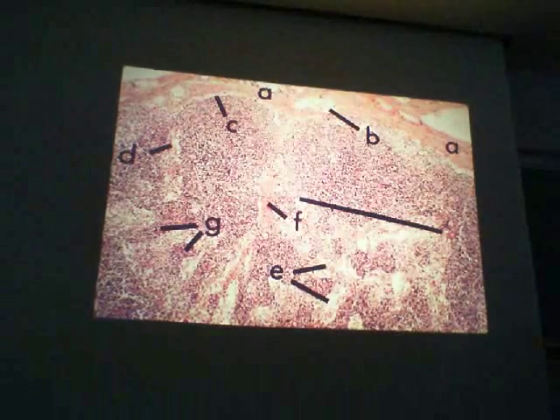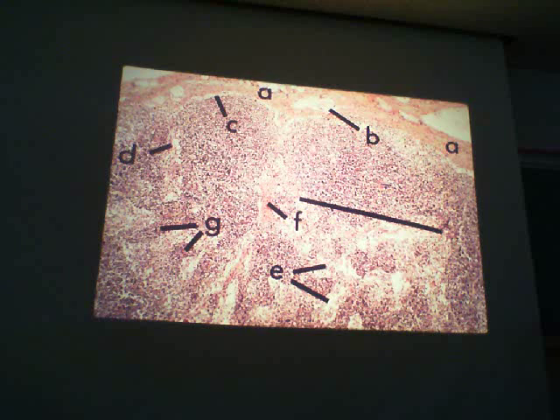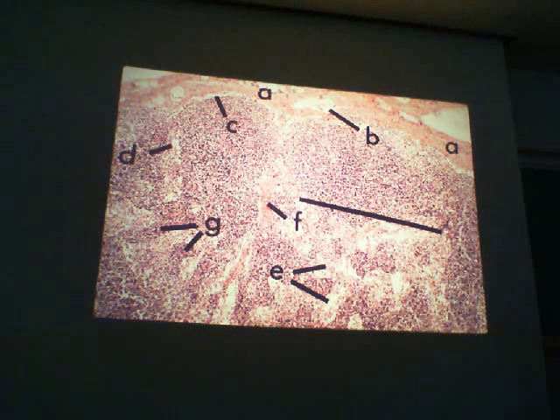Okay, so we've got the nodule right here, so this is all cortex. There's the capsule. How about this vessel that we see out here coming through that capsule? Okay, that would be an afferent lymphatic. And then we can see a portion of the capsule coming down that forms a what? Trabecula. Okay, let me get the other carousel up.